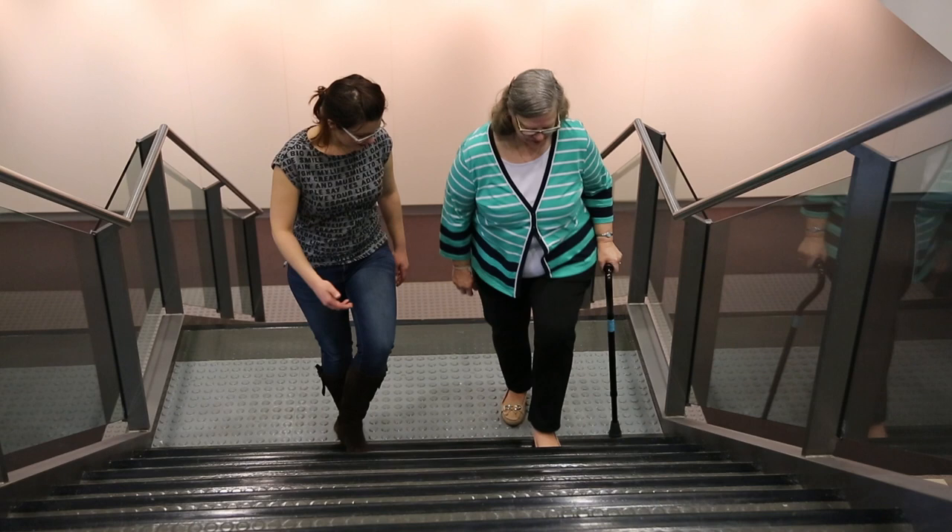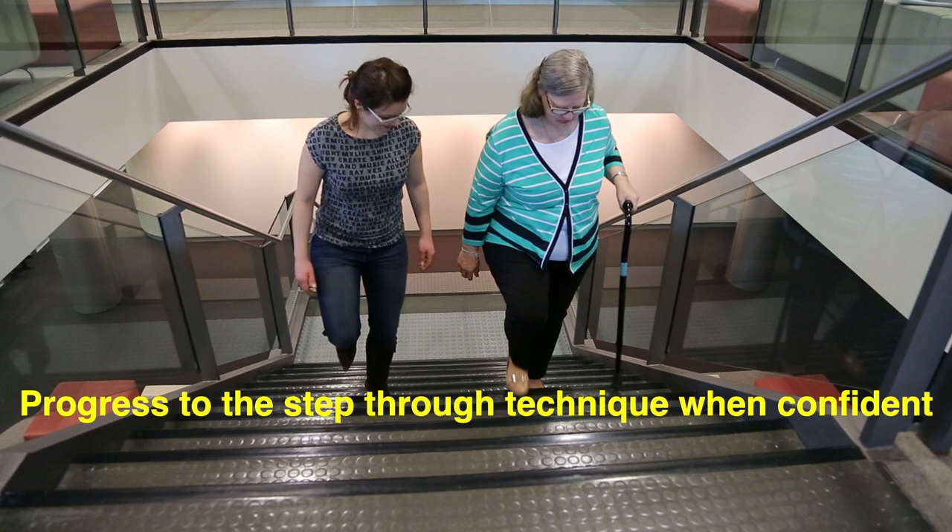When the patient feels more confident on the stairs, you can progress to the step-through technique. It's going to feel a lot harder to walk with a walking stick to start with and you may find you walk slower. But with about one to two months of regular use, you will find that you start to walk quicker.